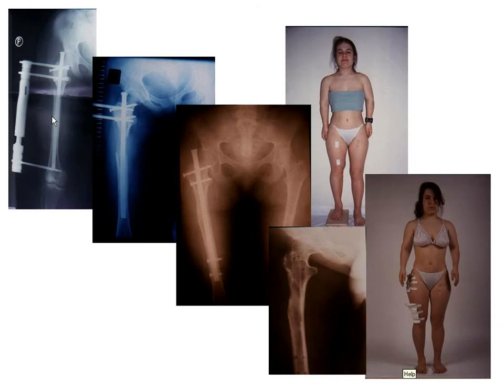So the application of the fixator takes 45 days. That's enough for the patient, so it's quite good for them. In another case, with a chondrodysplasia patient, there was lengthening of 8 centimeters. Here you can see one side is already lengthened, and the second side is starting. The same procedure: application of the rod, external fixation, osteotomy, distraction, and when we have made the distraction we lock it. You can see that the regenerate still continues to develop, and the patient after that is quite satisfied.